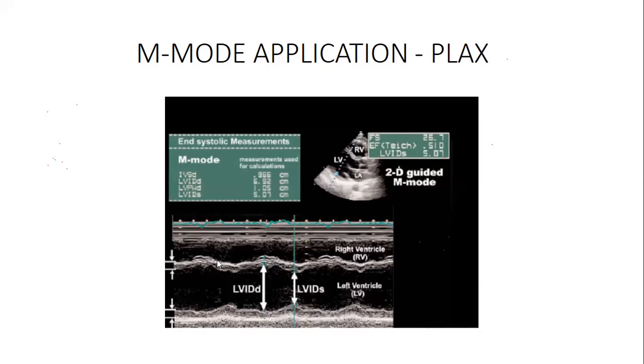This line, it's up, down. It's up, down. So this is in diastole when it's like this. When it goes down, it's in systole. Okay? It goes up in diastole. So it's caving and it's in synchrony.